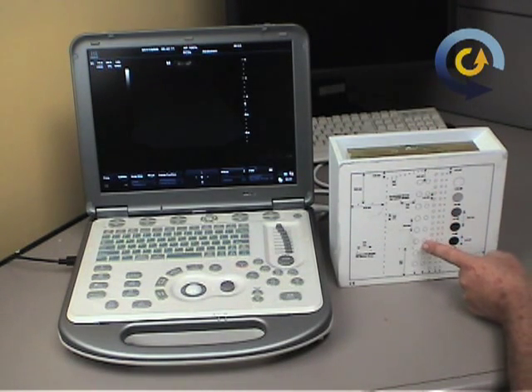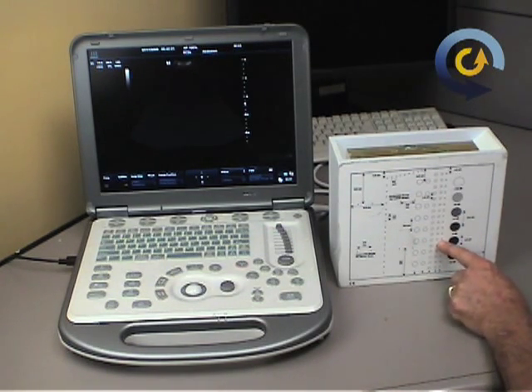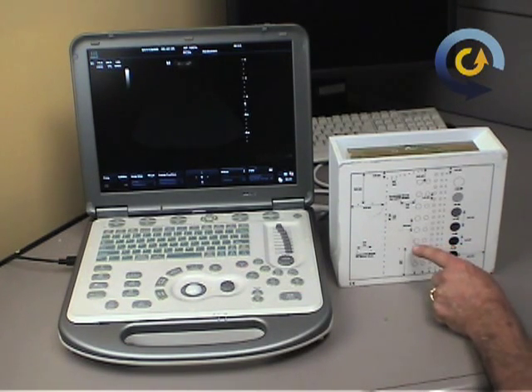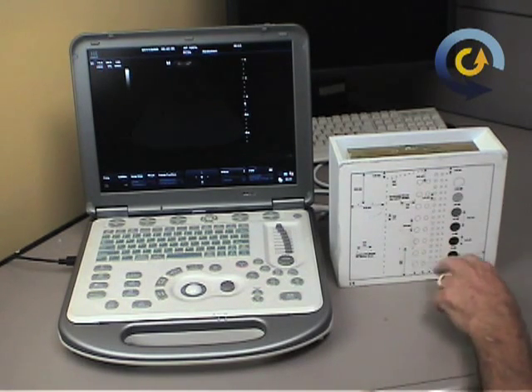These represent cysts, and these are hollow plexiglass rods again, and they're clear as you look at them with the ultrasound. So what you're trying to do is find out how small of an object you can still see the difference in the contrast between the surrounding tissue and, say, a cyst, and you also want to make sure that that cyst is clear. It doesn't have a lot of echoes in it. And that's what each one of these are for.